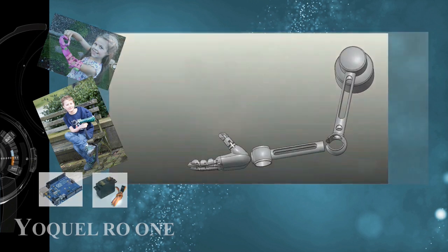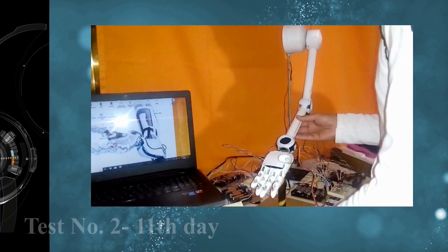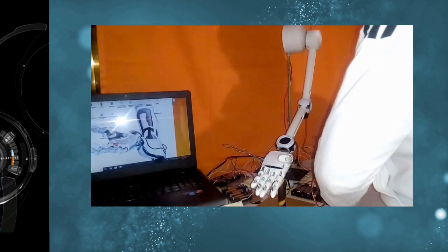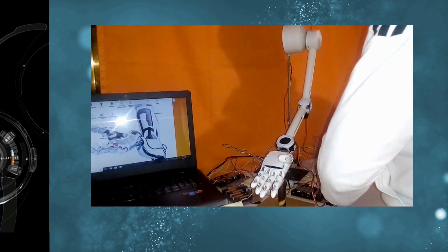For the moment, it's just a prototype. It's necessary to strengthen the shoulder, give more stability to the arm, and improve the movements of the hand. I expect it will be functional soon. The objective of the prosthesis is to hold a pencil, a spoon, and a glass of water by itself.